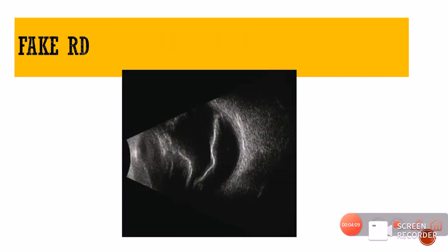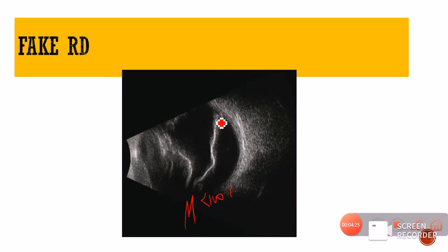This next image looks like an RD, but it is actually nothing but a membrane. How do you differentiate it? The reflectivity will be different — the spikes will always be less than 100%. Additionally, it is not uniformly attached and it is not even attached to the disc. Since it has no disc attachment and reflectivity is less, and on after movement testing this membrane is freely mobile, it indicates it is just a membrane present in the vitreous and not really an RD.